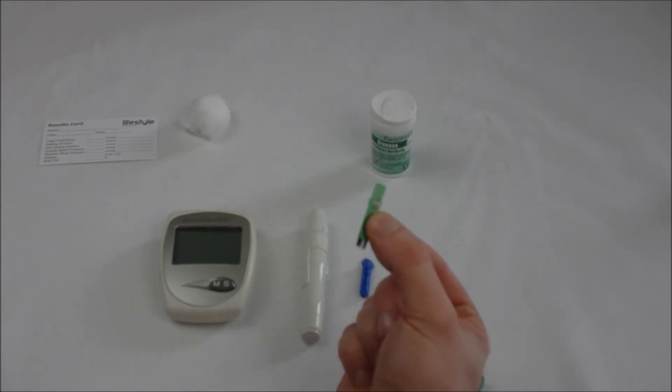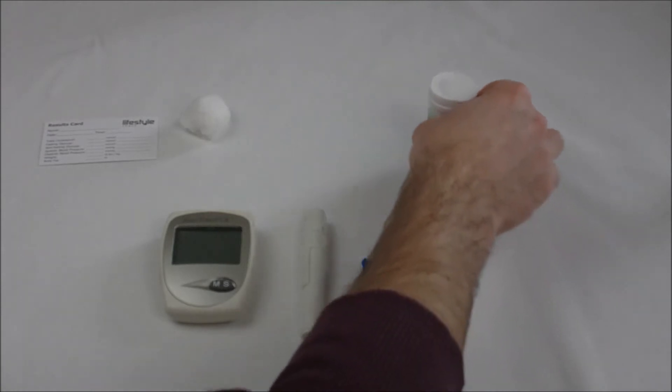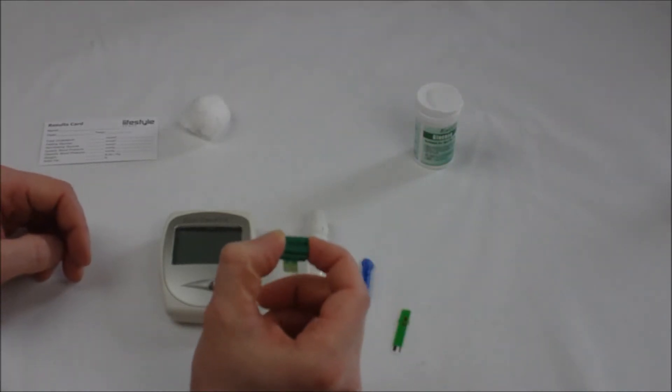You'll also need your green glucose test strips and your green code key, both of which can be found in your vial of glucose test strips. The first thing you're going to need to do is insert your code key.